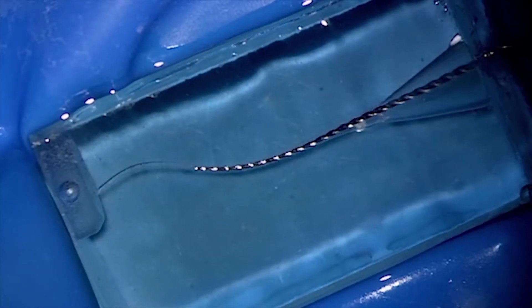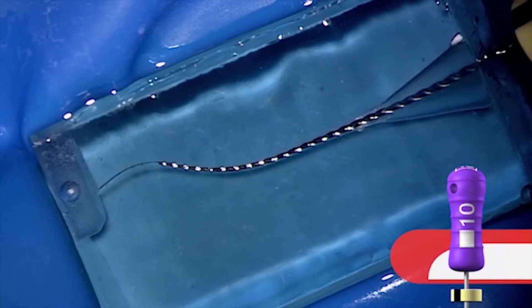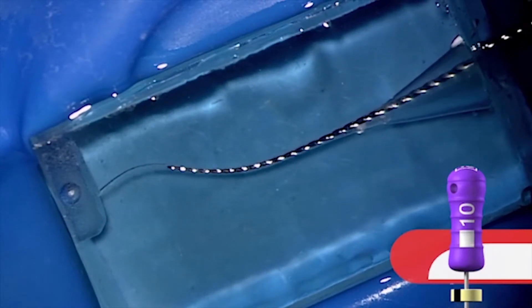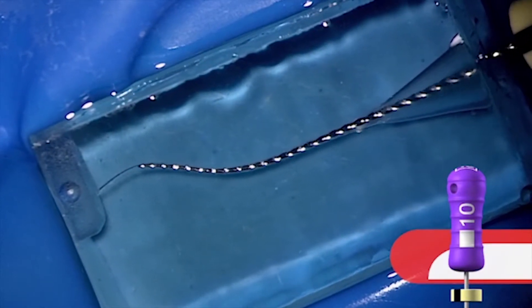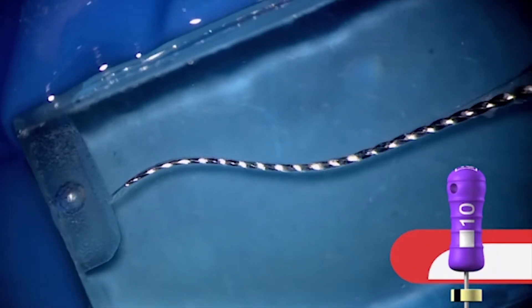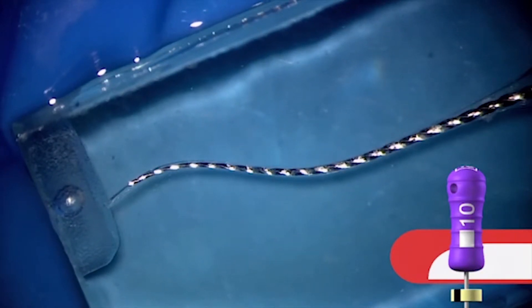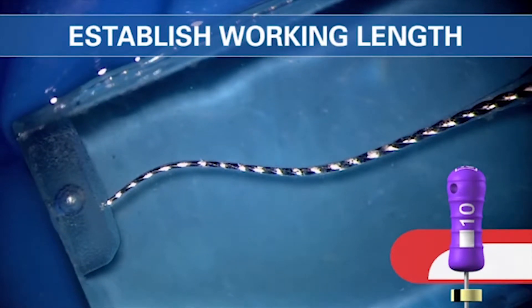Here comes our 10 file. Notice the rubber stop — it's doing very small back and forth reciprocatory motion. It's not really making a big motion, just a small back and forth rocking. When you get that file down the canal and get about a half or one stop short of length, let's not reciprocate the handle more so we don't transport. Let's just slide in — slip and slide. By slipping and sliding to length, we are now able to maintain the position of the foramen.